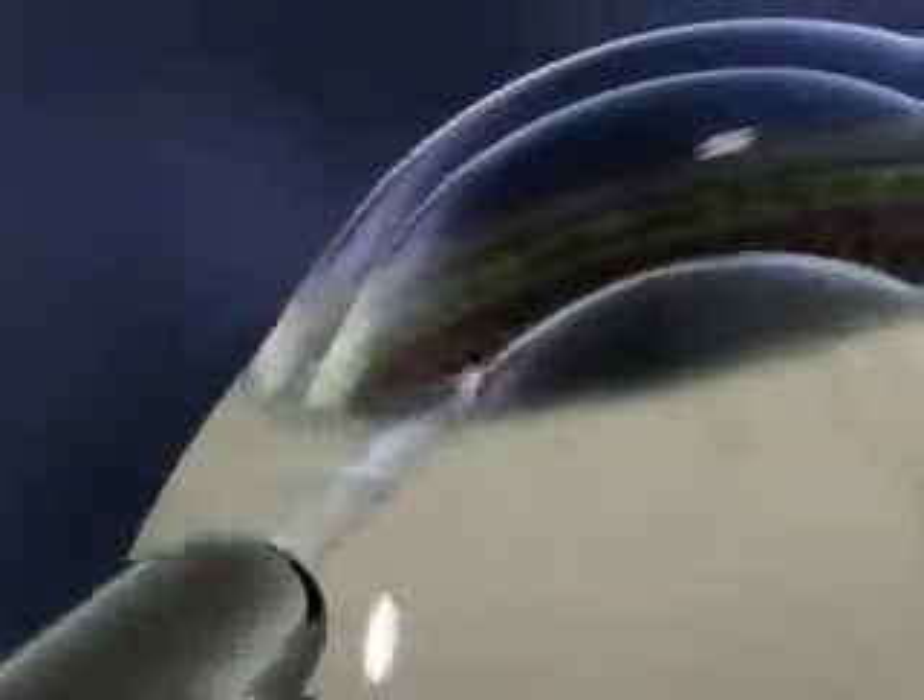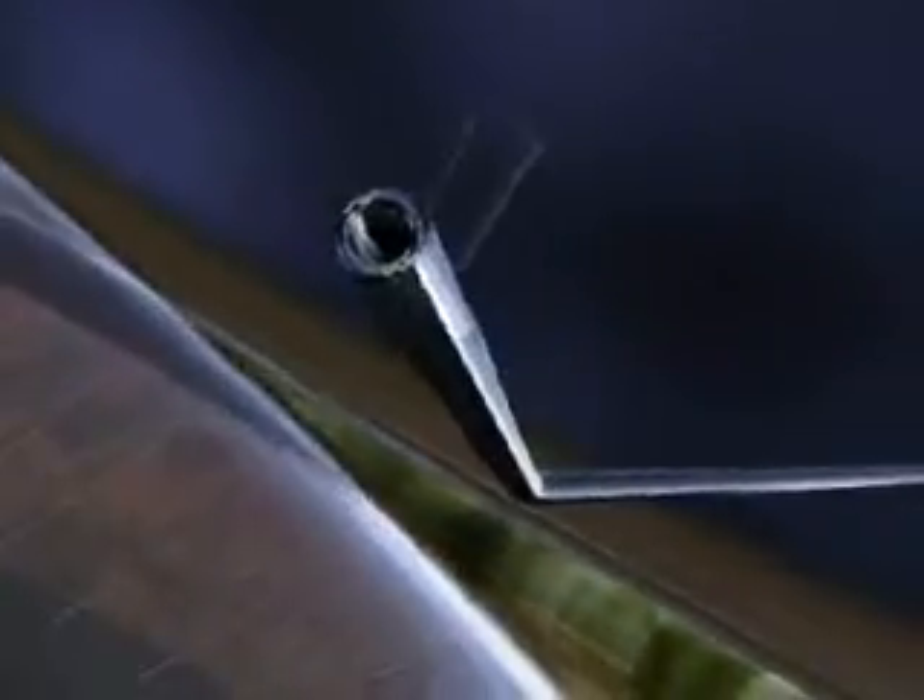First, the doctor will create two small incisions at the base of your cornea that will be used to position the lens. Next, a gel-like substance will be placed inside your eye to protect the eye during lens placement. This gel will be removed at the end of the procedure.